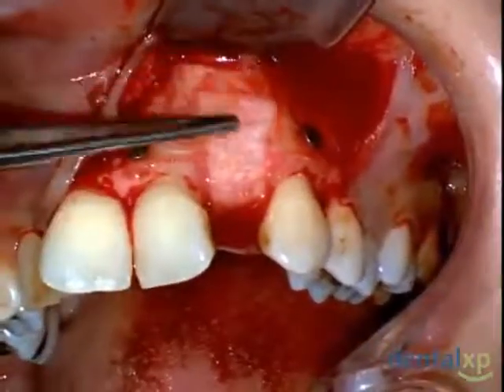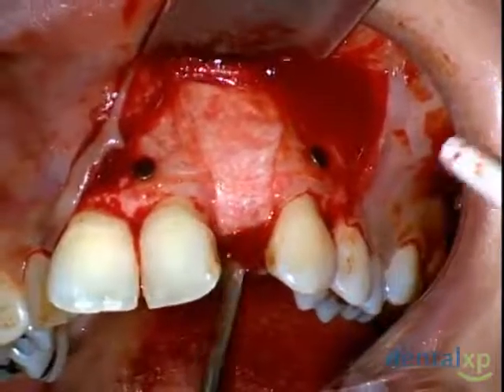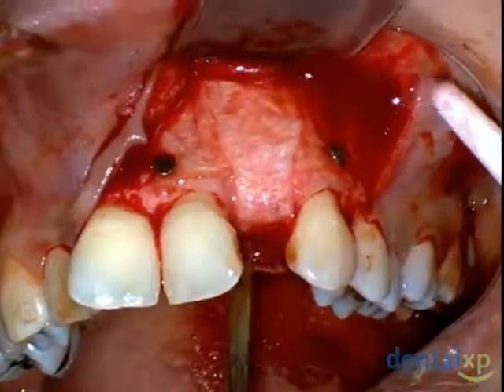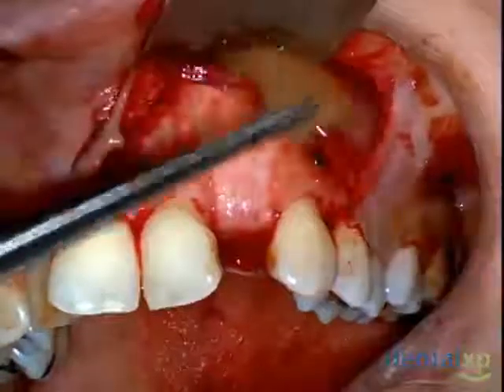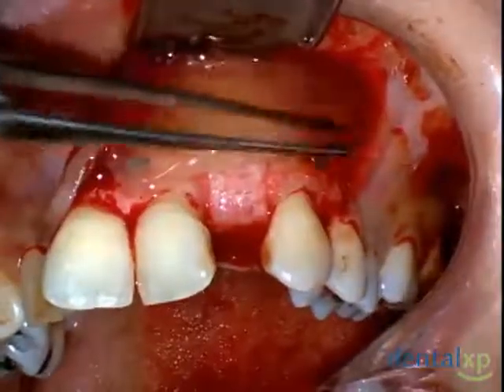This allows us now to have regeneration occurring both from the occlusal aspect as well as the labial aspect, completely covered and protected by a resorbable collagen barrier that gives us a long-term barrier function. The fibrin membrane, although very nice to utilize, has a shorter membrane function. It starts to resorb in approximately 3 to 4 weeks.